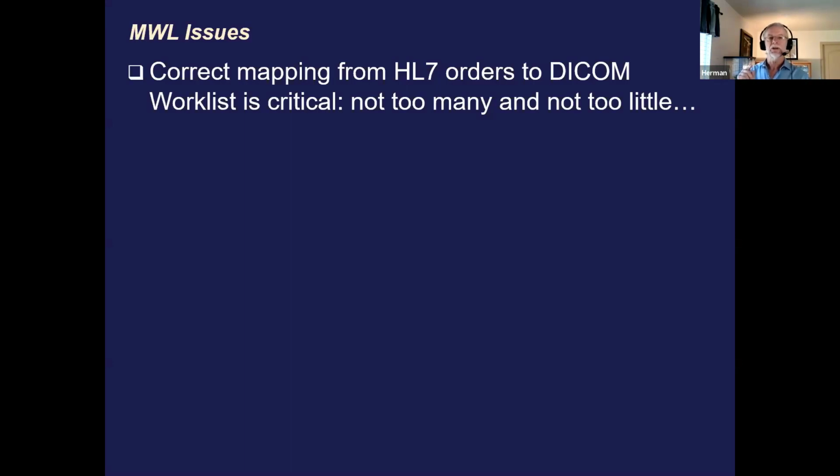But if you're in the inpatient, maybe you want to see the worklist for both inpatient CTs, because you might actually have them across from each other, and depending on which one is just available, we go to either one or two, particularly in the cases of ER or whatever, right? So the first one that is available. So that's an example of, we don't want too many and not too little, right? Because again, not too little, we want to make sure that for both inpatient CTs, we have all the information of anything that is with inpatient CT.